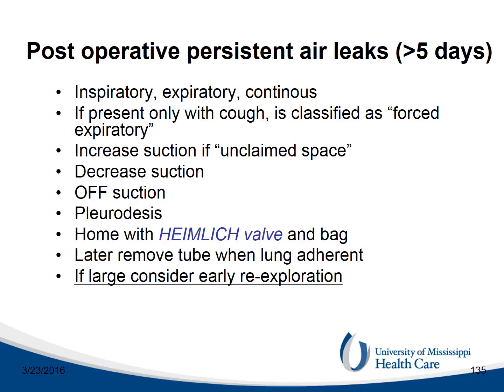Air leak that persists more than 5 days after surgery can be watched as small or moderate. Changes in suction in either direction can help. The patient can often be discharged home with a Heimlich valve and the chest tube removed later as an outpatient. However, large air leaks usually need to be re-explored and sutured.